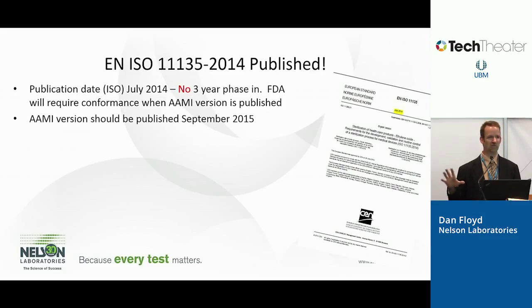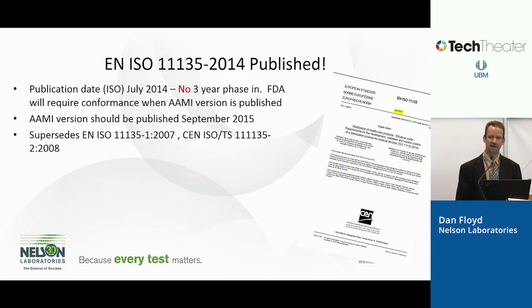There are not a lot of huge changes in how you do the validation, but there are some subtle changes. We'll go through some of the main changes throughout the document. Again, the intent of this revision was to merge the document into one single document. It used to be part 1 and part 2. Part 1 was the normative part, where all the requirements were. Part 2 was the guidance to the document.